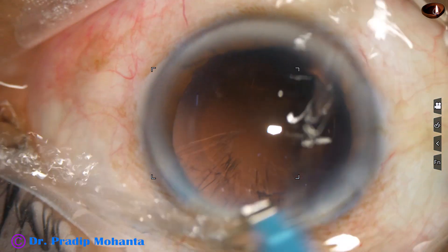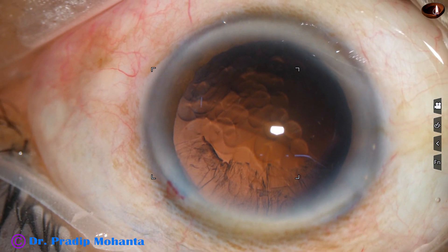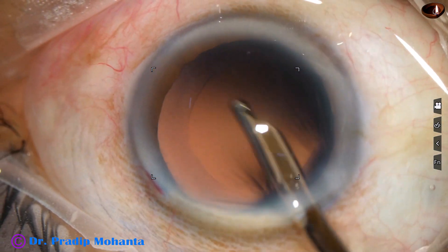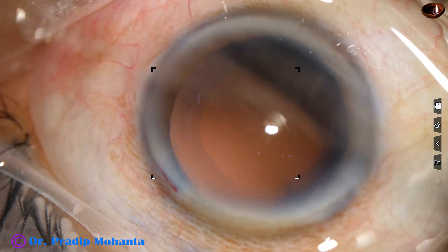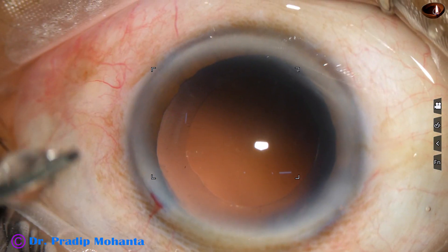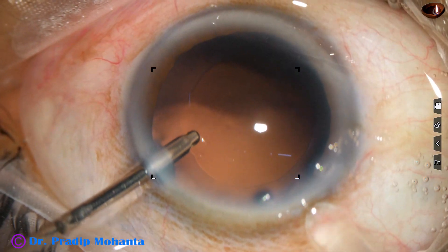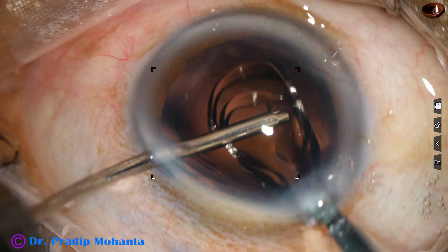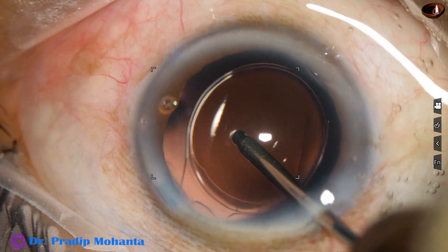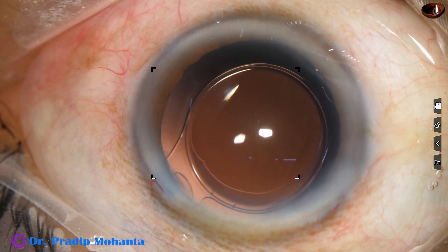The nucleus has been managed. There is some cortex from eleven o'clock to two o'clock, which came out easily with the Simcoe cannula — this is a 22-gauge Simcoe. Now in this case, we are going to implant a single-piece monofocal intraocular lens. The lens goes into the capsular bag and is placed nicely in the bag.